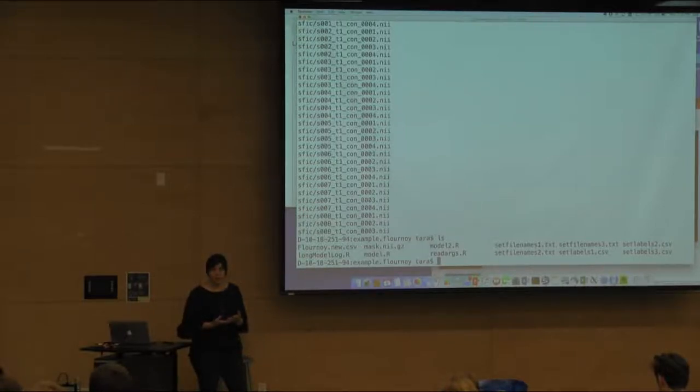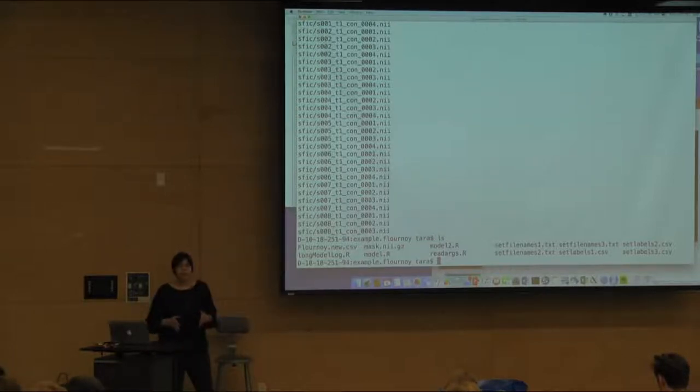And then hopefully we'll have a little script for you that it would be very straightforward for you to just run that and cluster correct your data. And this is approved. We know that this is reasonable. At its worst case, it might be a little too conservative, but as long as you do the estimation of the smoothing correctly, that should be pretty good for fMRI data.